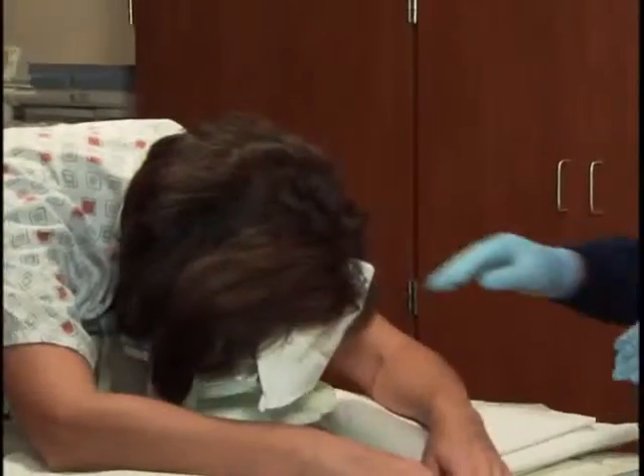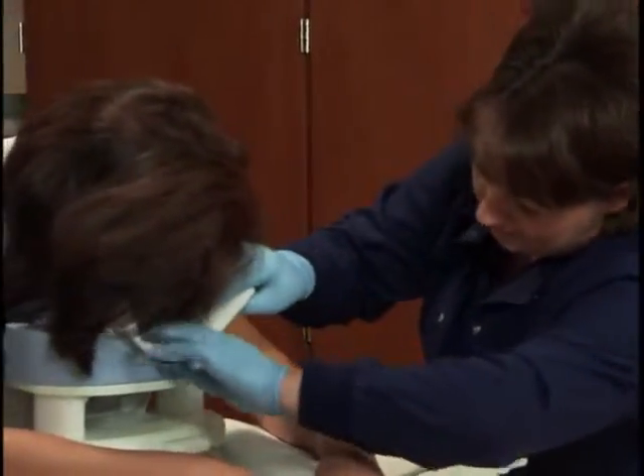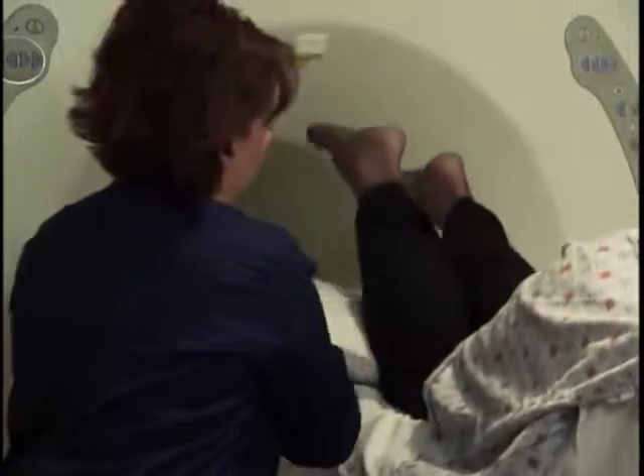If they are compressed, bring the patient back out of the scanner and pull the lateral plates out until they are just touching the breast. Remember not to rush the positioning part of the exam. Take time to make sure the patient is comfortable. Place pillows under the patient's legs and feet.